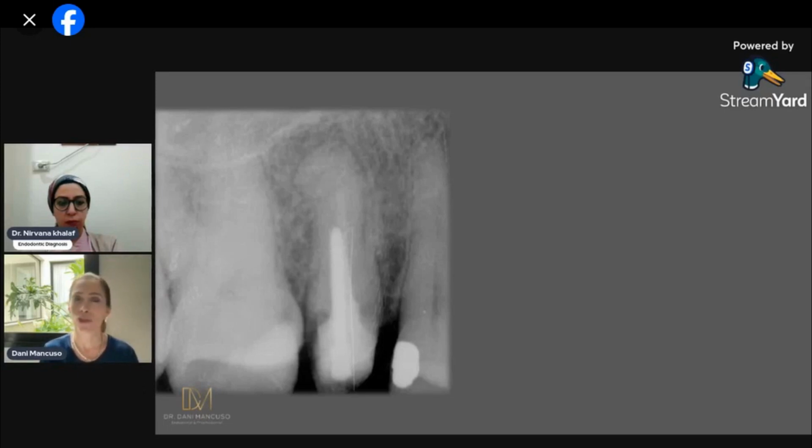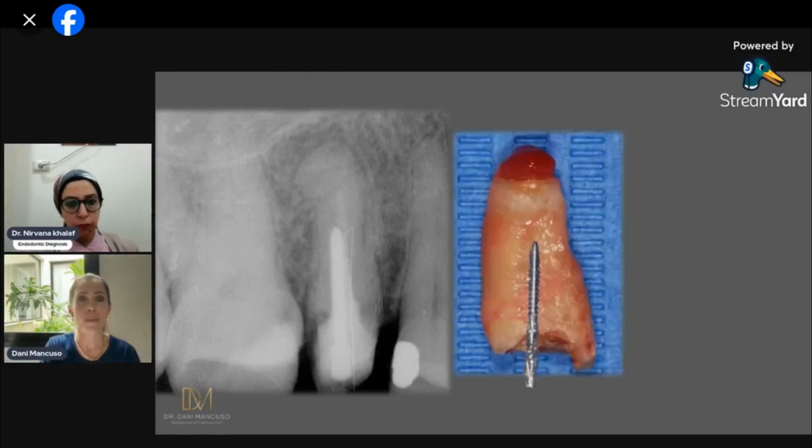In this case, there was lots of caries compromising the ferrule of that tooth. You can see the post is pretty centered apparently, but no root filling over here, or just defective. A bit of radiolucency, hypercementosis perhaps. But it's all about the combination in that case.